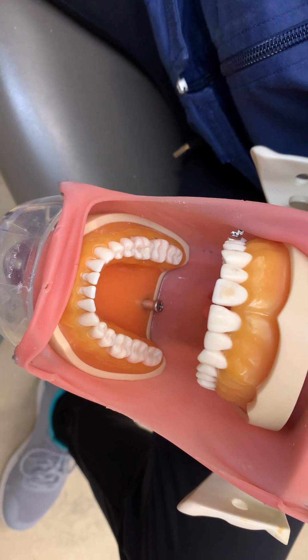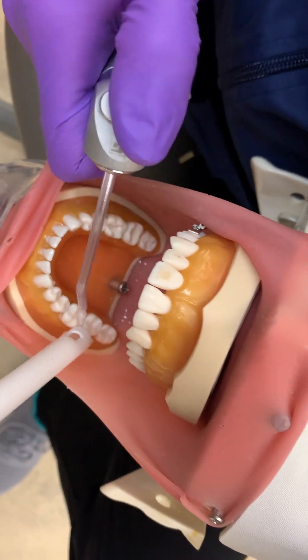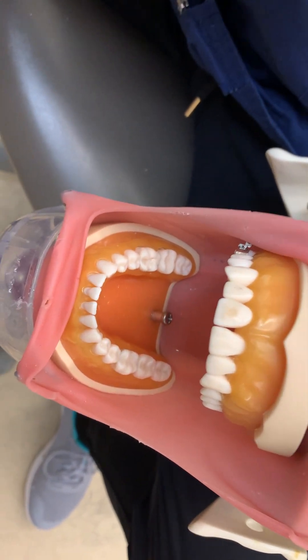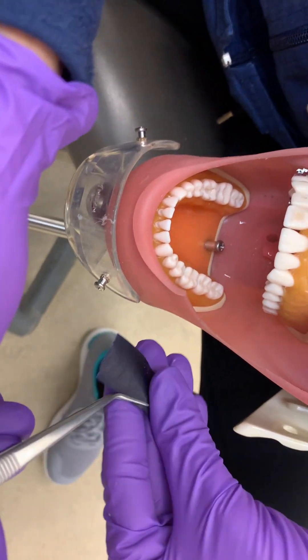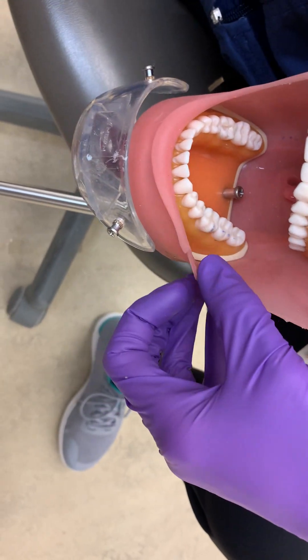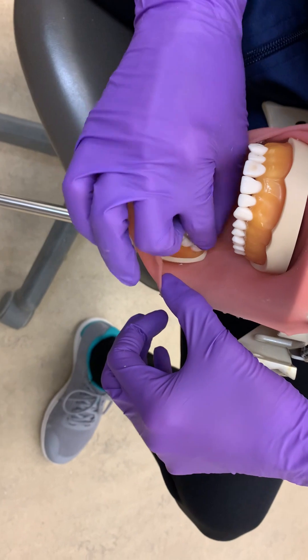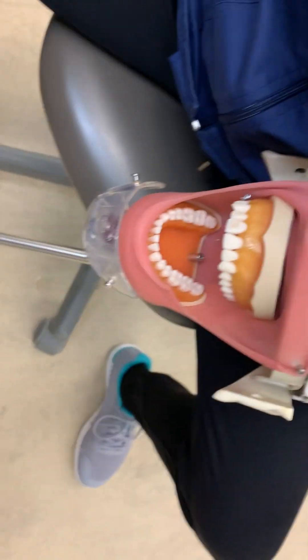She will allow the client to rinse if needed or give the client a rinse. She's going to check the bite with the articulating paper to make sure there are no high areas. If there are any high areas, we would need to have the dentist or the dental hygienist come and remove any excess material. If there are any post-op instructions, you would give the client those instructions. Make sure that you clean the tip of the light and handle with caution using a disinfectant according to manufacturer's instructions. Thank you and that's the end of our tutorial.